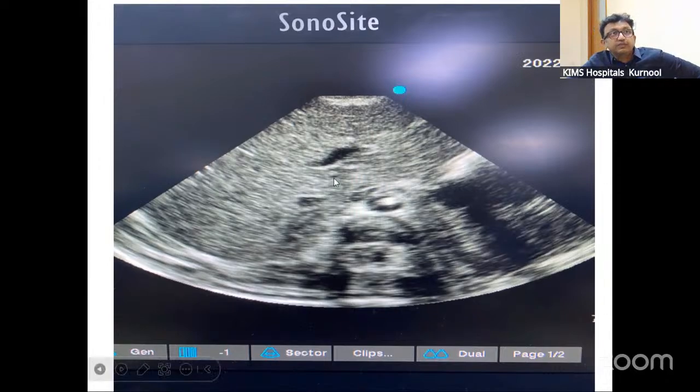So if you keep glancing or keeping an eye on the vasculature there on a regular basis, you will know when it is abnormal, right? It helps us differentiate what is normal from abnormal. So in this position, this is the vertebra, this is the aorta, this is the IVC, and this is the liver, right? So this is in the 3 o'clock position, looking straight downwards, the probe pointing directly downwards.